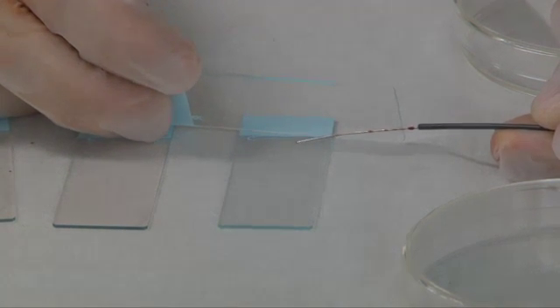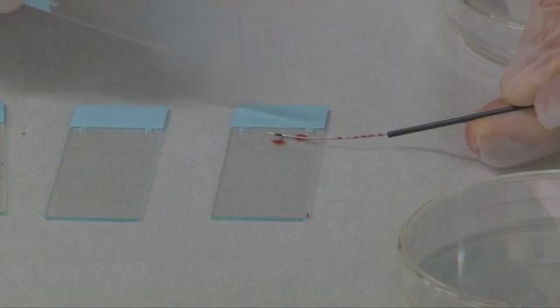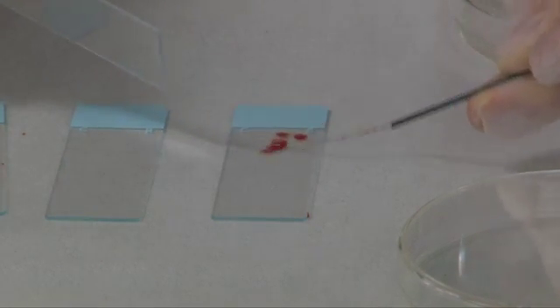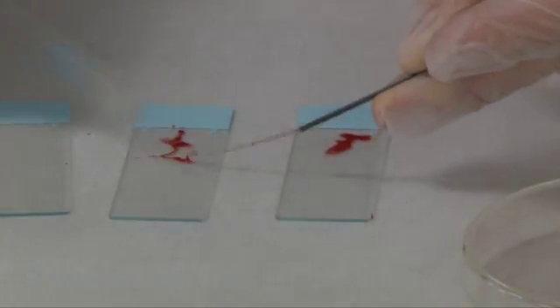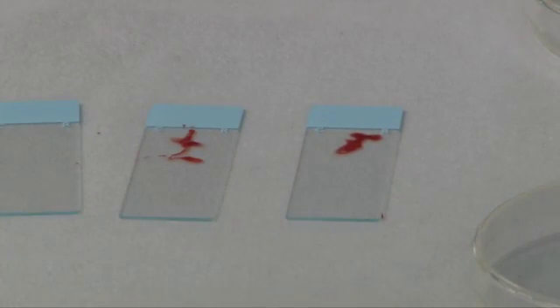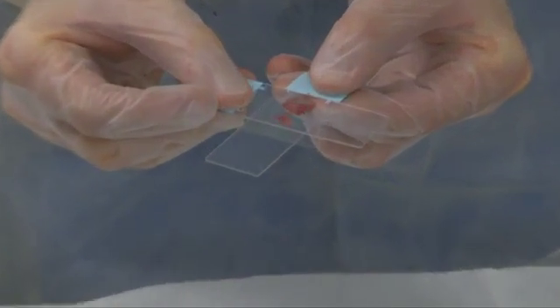So we have discussed before with the colleagues here. So okay, go ahead. So we're expressing the sample. Anna is expressing the sample with the stylet. So this is the most controlled way to do it. We make the slides, and then we would put the rest in a preservative, in the cytolite.